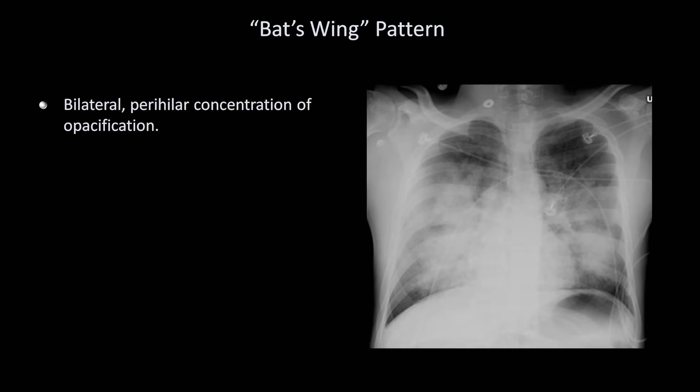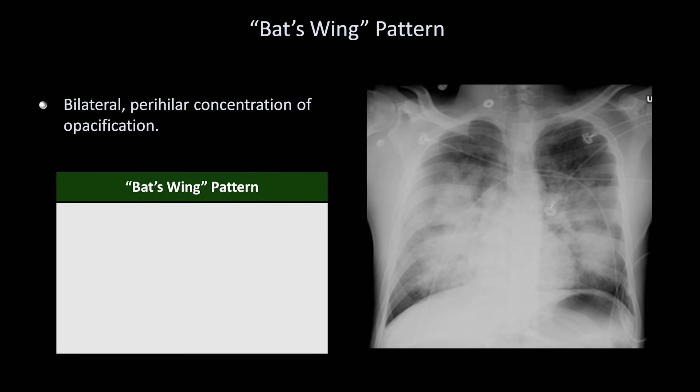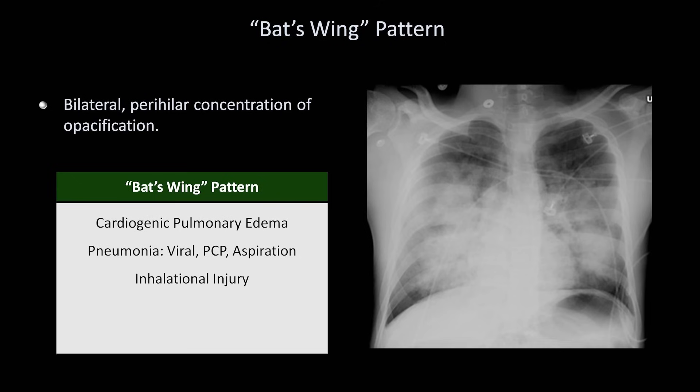Lastly is the so-called bat's wing pattern of opacification, sometimes referred to alternatively as a butterfly pattern or angel's wings. This refers to bilateral perihilar concentration of opacification. This is seen predominantly in cardiogenic pulmonary edema, but also in some types of pneumonia, particularly viral, PCP, and aspiration. It can be seen in inhalational injury, pulmonary alveolar proteinosis, and in pulmonary hemorrhage.